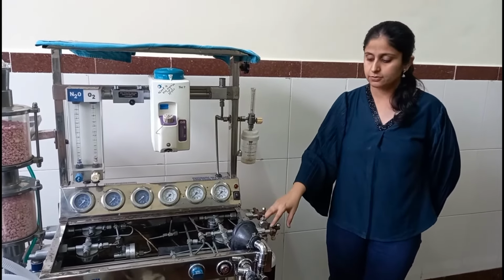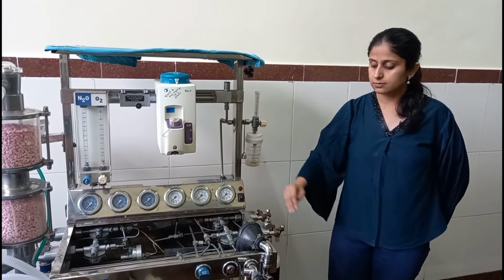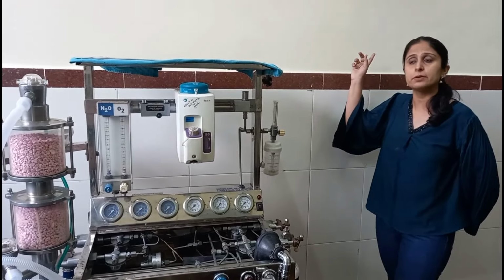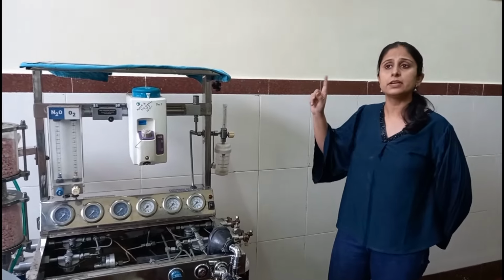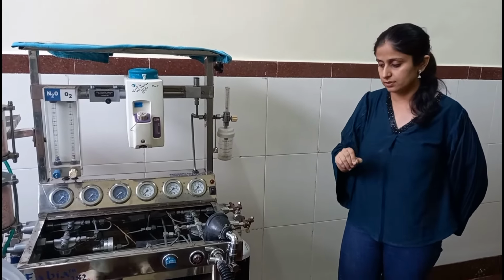So this pin index safety system is a very important safety feature. First is the color coding of the cylinder, second is the pin index safety system. There are also pipelines coming from the outlets, which follow the diameter index safety system, so that only a particular pipeline can attach to a particular circuit.